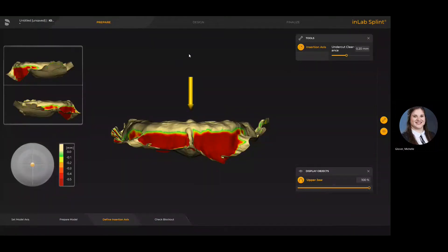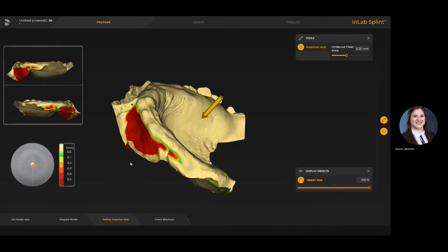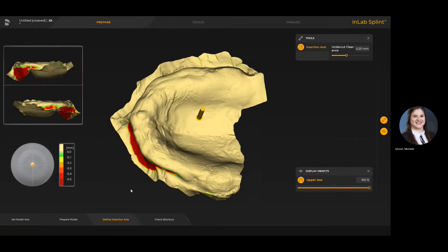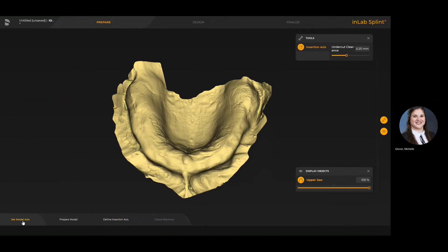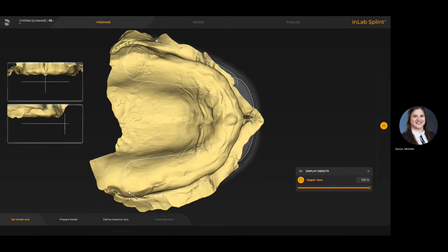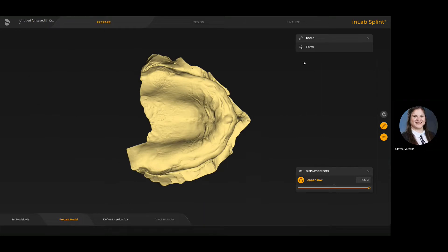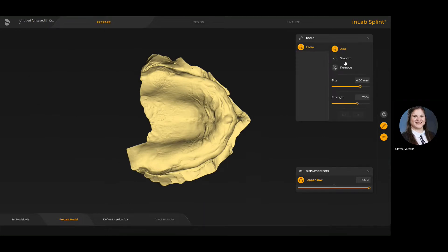When you first come into the software you'll be in the splint application, and it'll take you to the step known as define insertion axis. You'll notice that two steps were technically skipped by the software — the set model axis and prepare model phase. These were already completed in the CAD software or the Syriq software, so it's really just a way for you to double check if you want to go back. With the form tool you could do things like add, smooth, or remove material to the actual model itself. However, if those steps have already been completed, really the first step we want to do is define insertion axis.